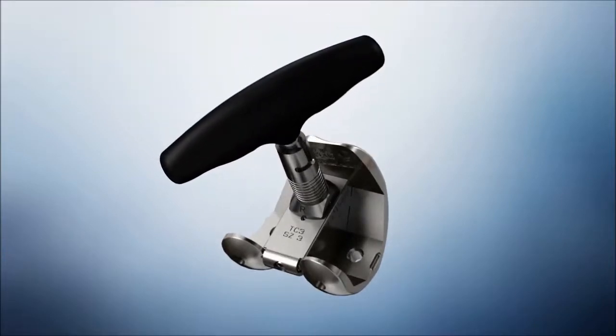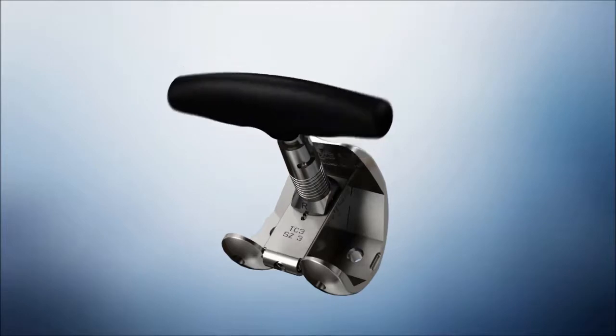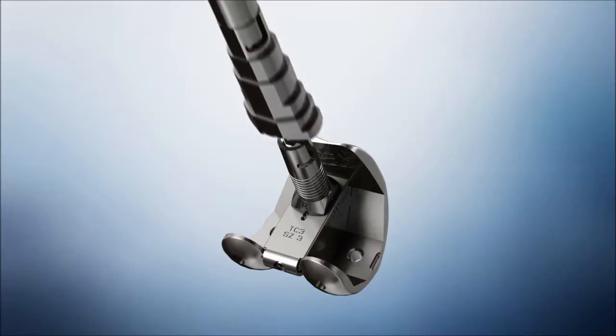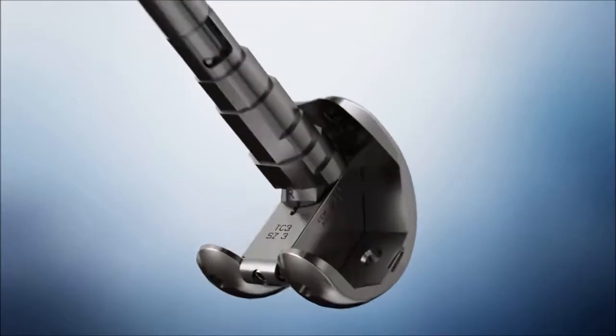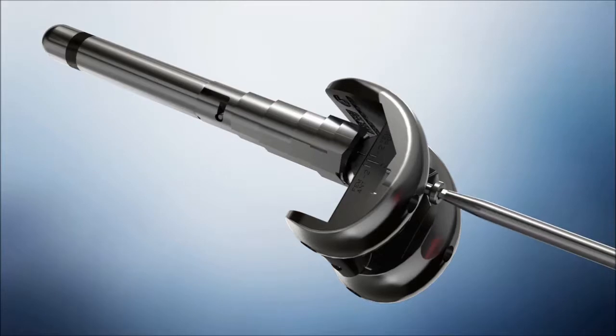Adjust the box trial adapter orientation to the appropriate L or R and +2, 0, -2 settings by lifting and rotating or translating. The L or R will be facing posterior when the appropriate left or right setting is selected. Assemble the appropriate stem trial to the end of the appropriate femoral sleeve trial. Assemble the femoral sleeve trial construct onto the femoral adapter trial. Pass the sleeve bolt trial through the hole in the distal box of the femoral trial and tighten using the HP revision screwdriver.